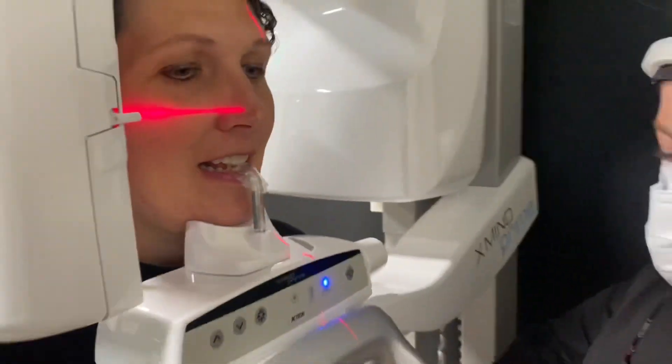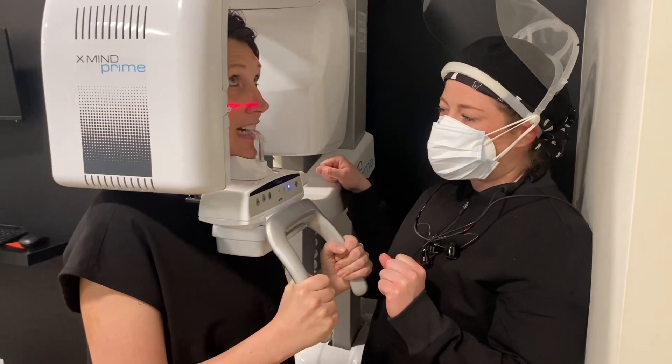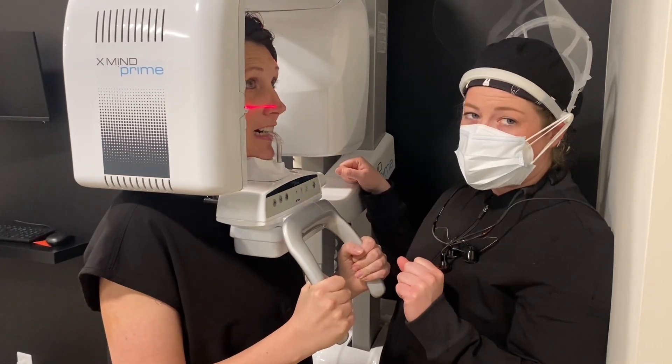When she's locked, we're going to hold on to these handlebars. Take a deep breath, swallow, put the tongue to the roof of the mouth, and you're ready to rock and roll.